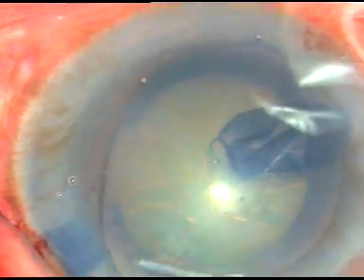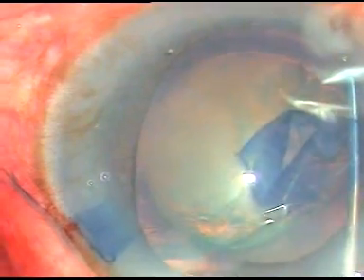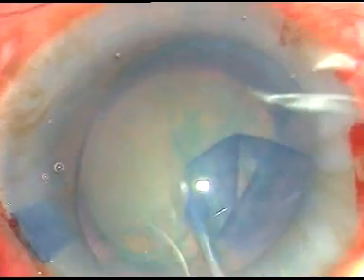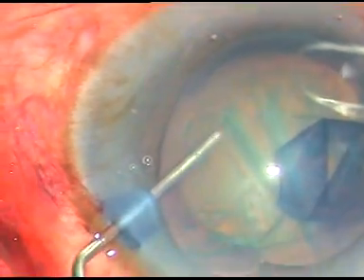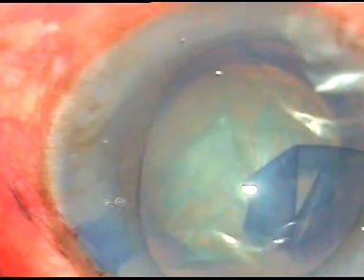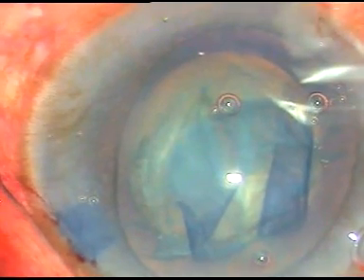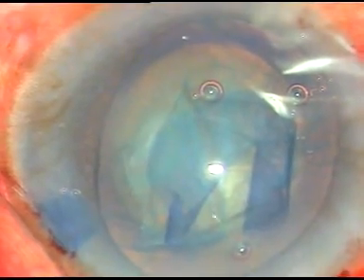Fluid wave is passed from one side, it has gone to the other side. Do hydrodissection some more on the other side. Depress the nucleus. And now I try to rotate the nucleus. But see, it's not rotating nicely. So I inject viscoelastic substance, and I have planned to sculpt out some lens matter. Again inject visco, and then try hydrodissection again.